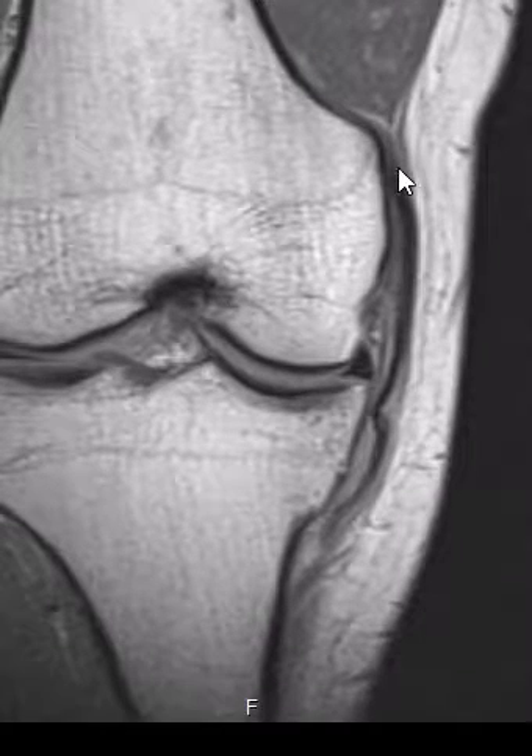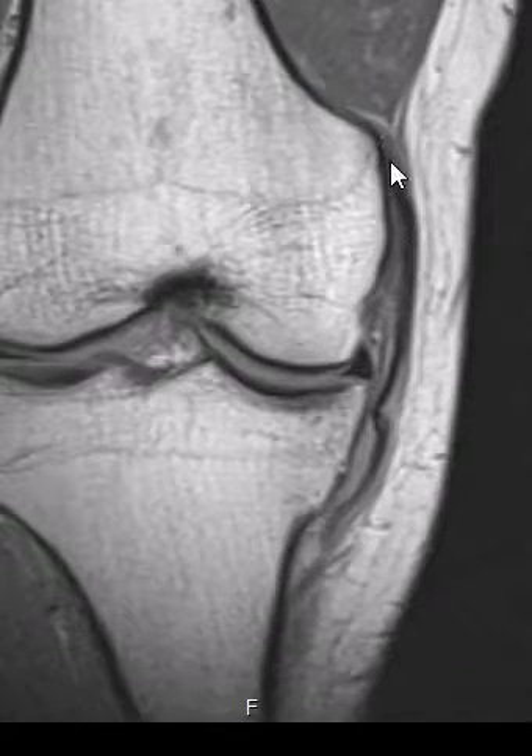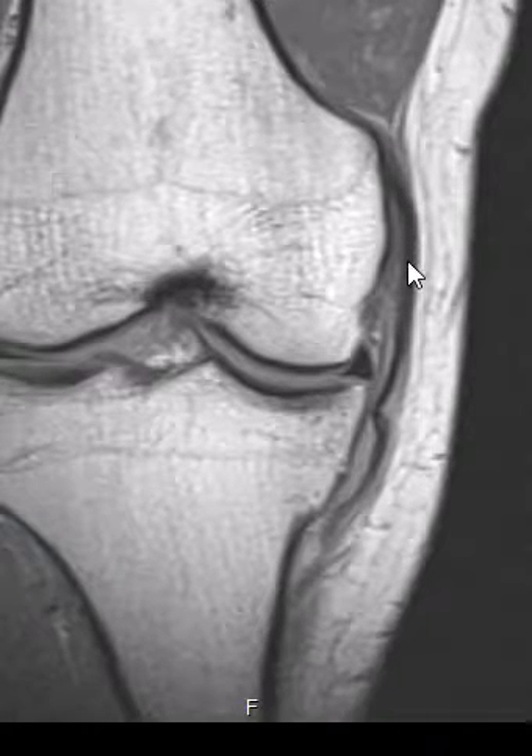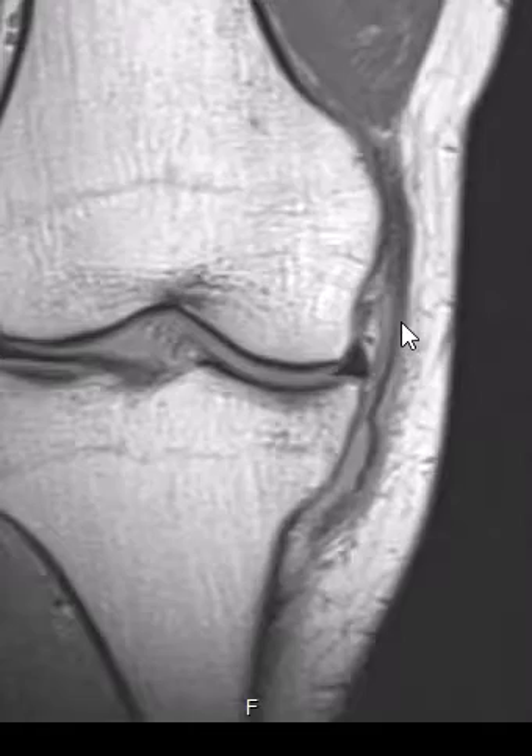On this patient, the thick outer fibers are right here. They come off the femur and come down to attach to the tibia down here. Instead of being nice and straight and taut, we see that the outer fibers — these thick outer fibers — are lax and they kind of make a wave. We know that they are ruptured distally and have recoiled back, which is why they look so lax.